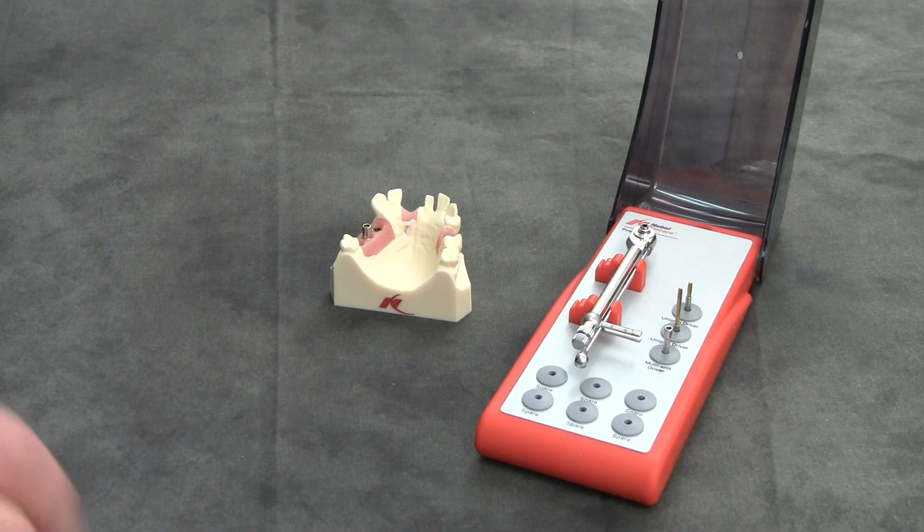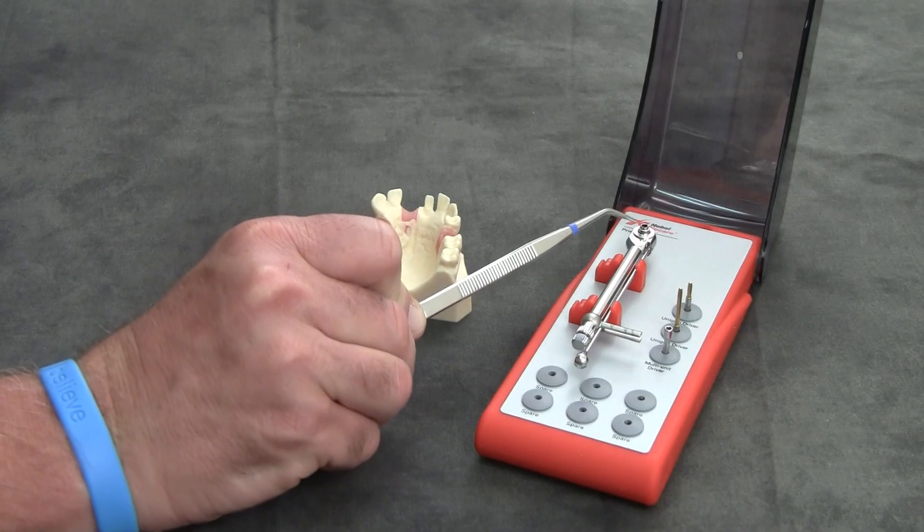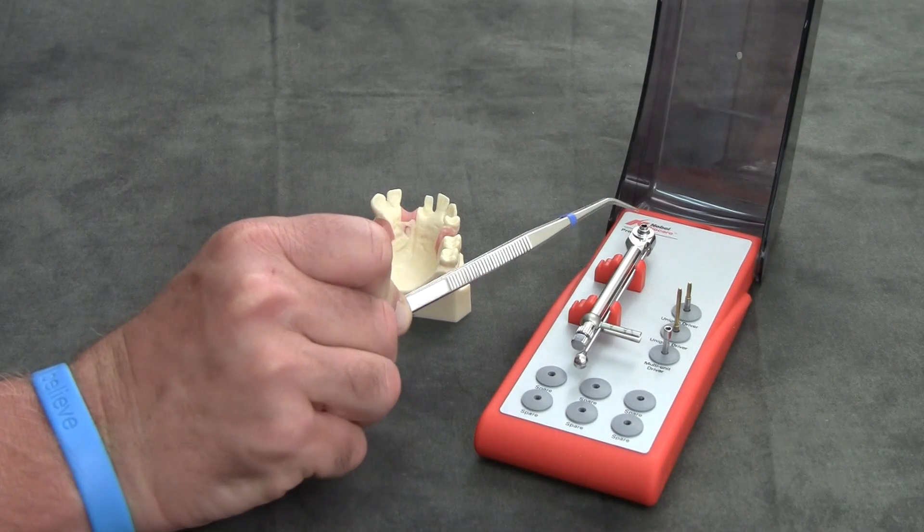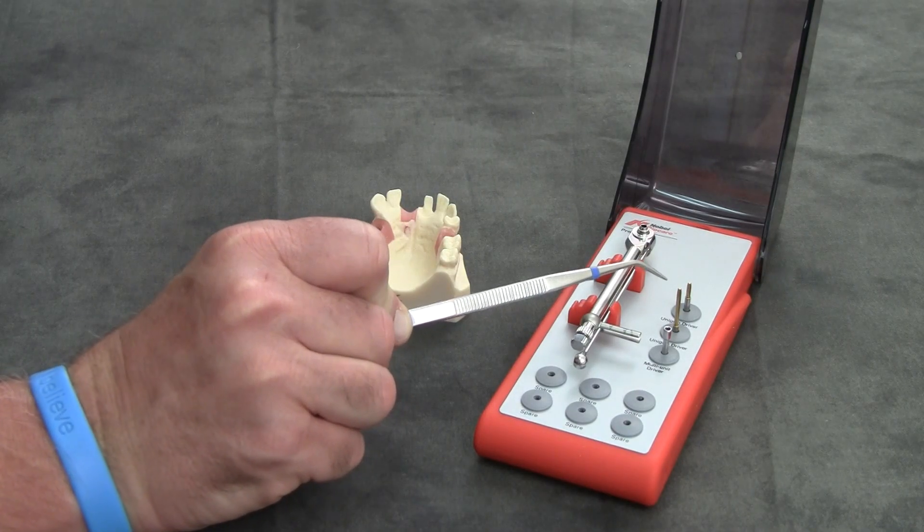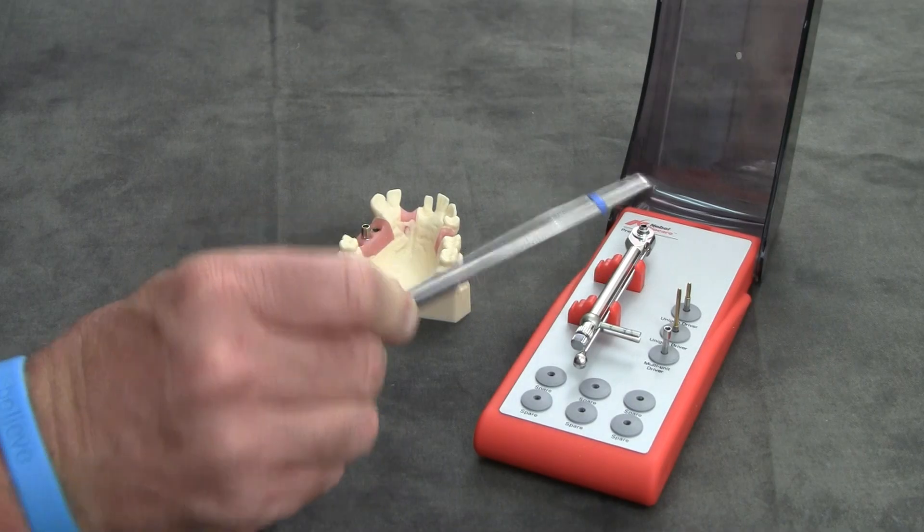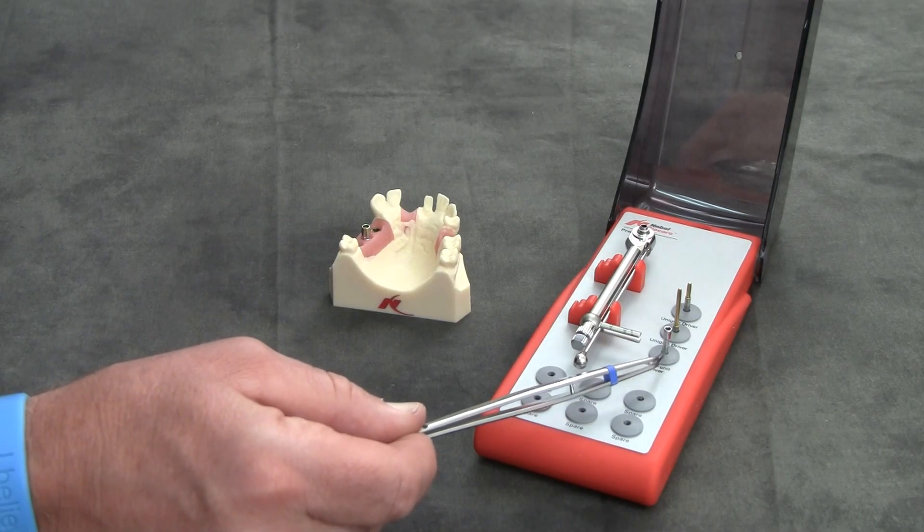In the kit box, you'll find the torque wrench with the hand adapter inside, the long and short uni-grip driver inserts, and here the multi-unit driver insert.